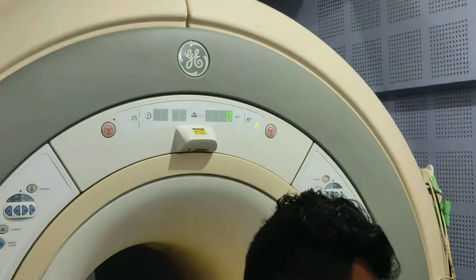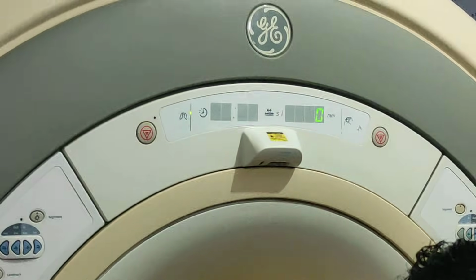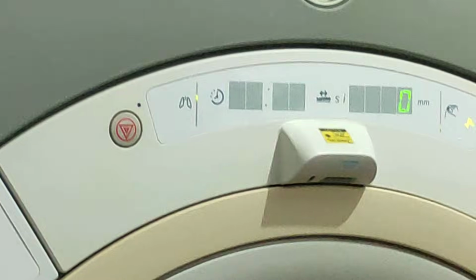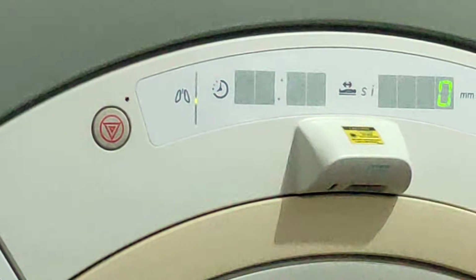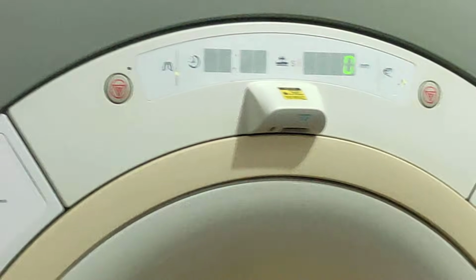Then you have to check over here in the system. This is the respiratory waveform going up and down, up and down. This is the respiratory indication on the system.